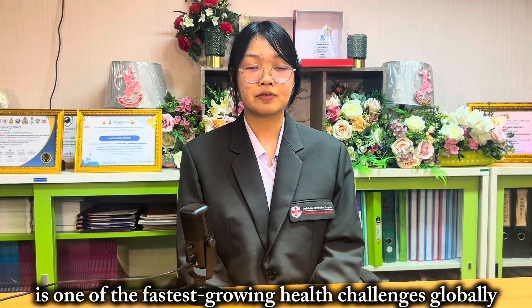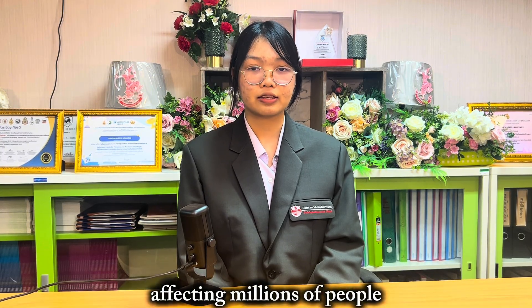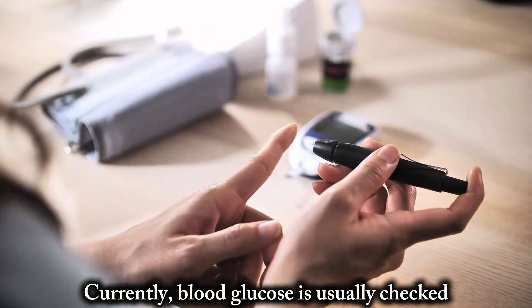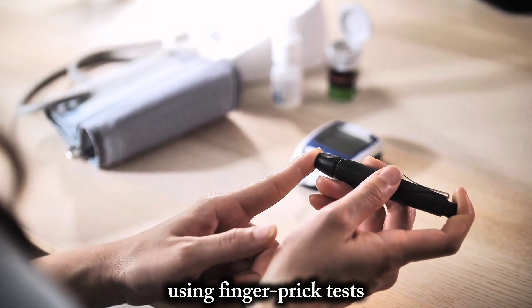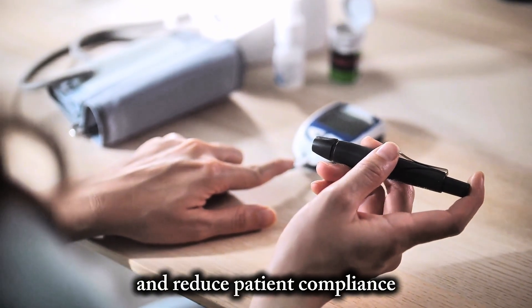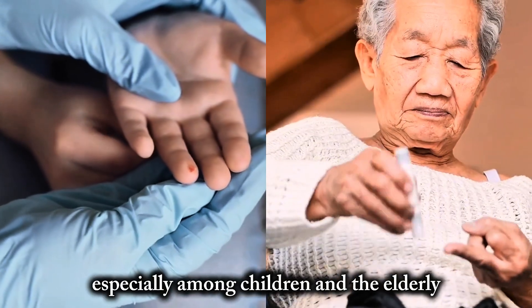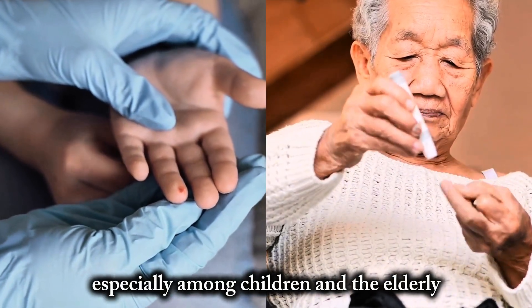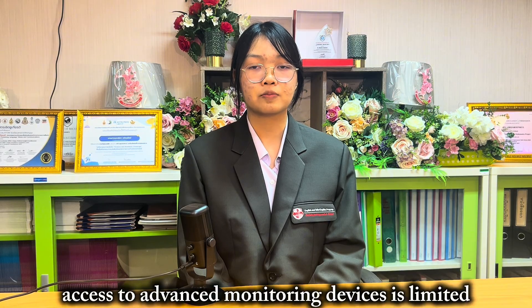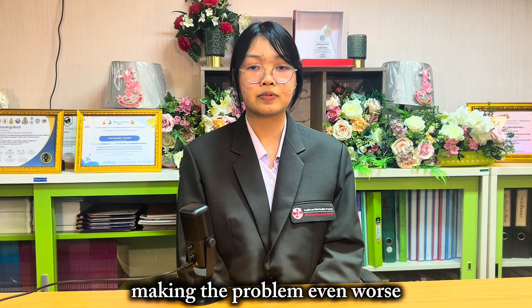Diabetes is one of the fastest growing health challenges globally, affecting millions of people. Currently, blood glucose is usually tested using finger prick tests. These are invasive, can cause discomfort and reduce patient compliance, especially among children and the elderly. In low-resource areas, access to advanced monitoring devices is limited, making the problem even worse.